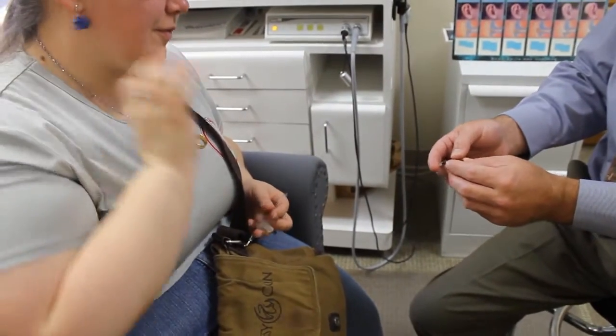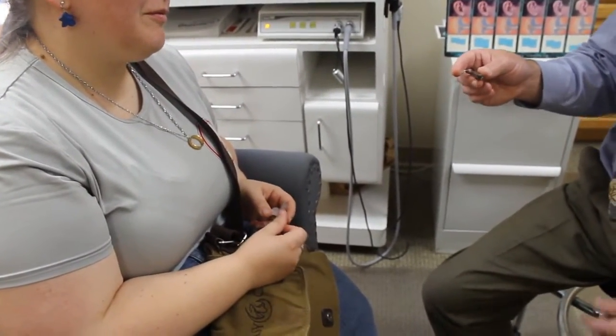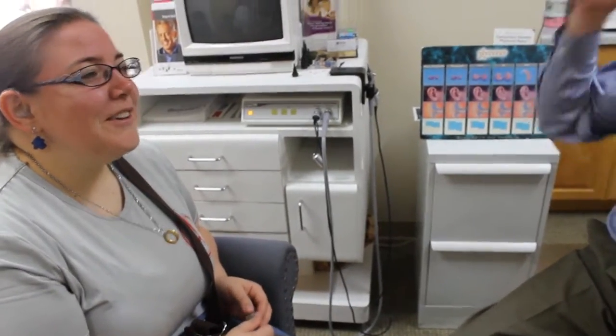You have to shut the door to turn it on. When you do that, it plays a little startup jingle. Now, I can make that go away. Yes, completely. It's simple. This one, the jingle is the default setting, meaning that when you put it in, it plays this little la-di-da-da-da, and then it goes away. I can go into the software and disable that.